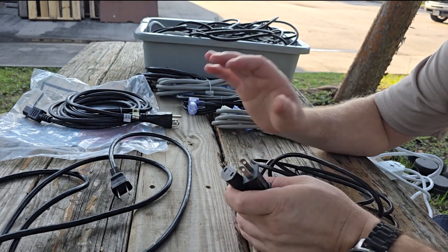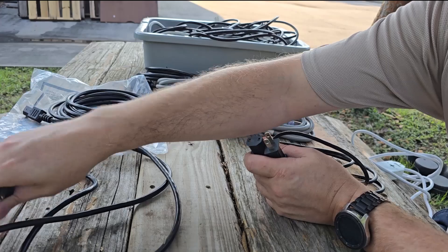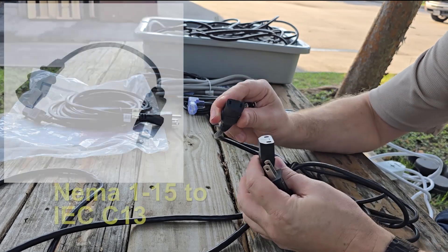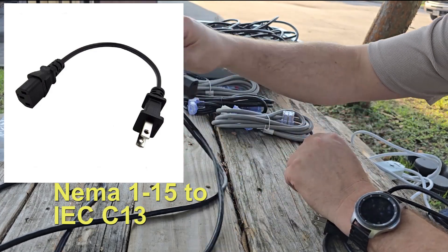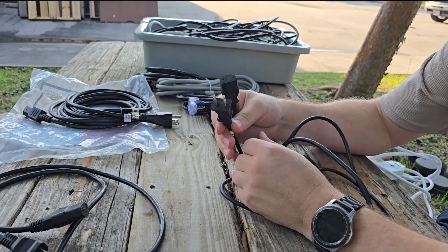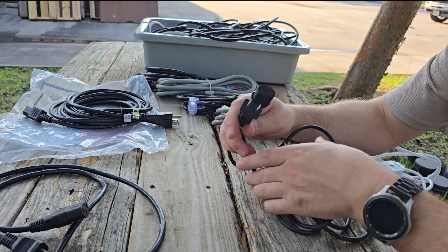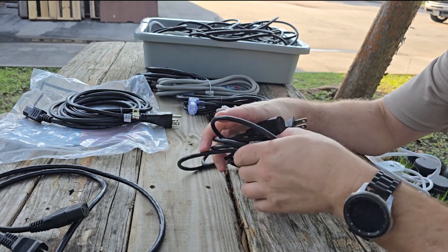It is entirely possible to have these non-medical cords in a medical facility and not even know it — they will often connect right up to your medical device. Sometimes they have the third hole for a ground conductor on the IEC end, yet they're only two-conductor. You can tell because it's a two-prong plug. These are not authorized in medical facilities. If you see them on any device whatsoever, get rid of them, because without the ground conductor you have no extra level of protection for faults.